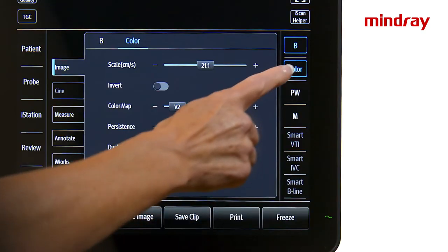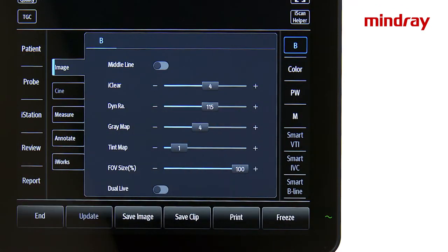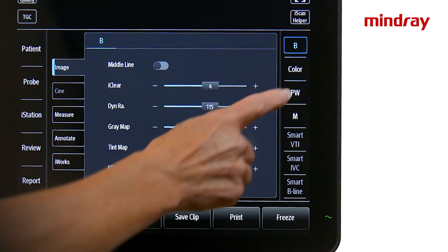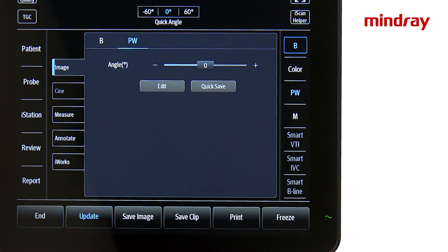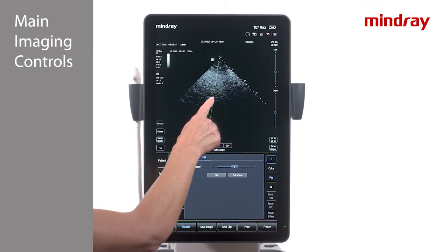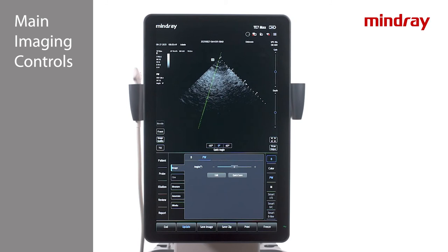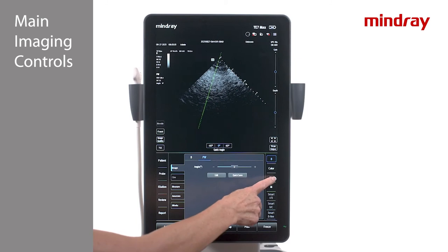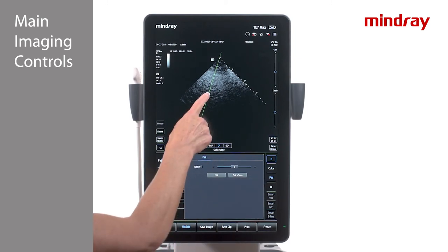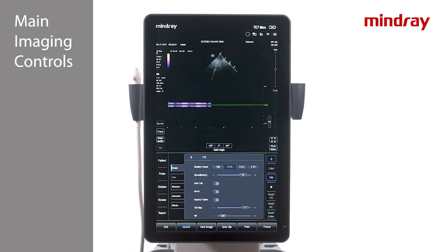To exit color mode, either press the color key again or press the B key just above it. To enter pulse wave Doppler, press the PW key. Position the PW sample gate in the desired position with a finger. There are three ways to activate Doppler: press the PW key again, press the update key which is highlighted blue, or double tap on the PW cursor.